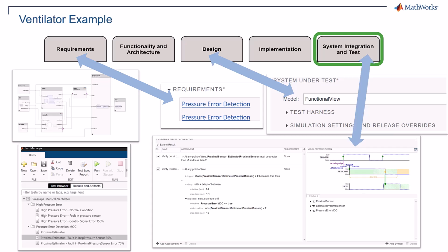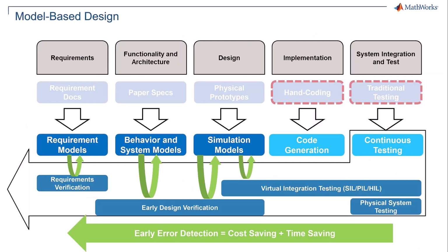If you fail to correctly investigate your need for redundancy, it will be costly to add the redundancy at a later stage in your project. As you can see by the arrows, each test case in the Test Manager has links to the requirements, the design, and also the fault to be injected. Your digital thread is safeguarded throughout your project, and it also includes the FMEA. To summarize, by focusing on simulation and automation, and by reusing tests and an agile workflow with a focus on early testing, you can achieve cost savings and time savings.